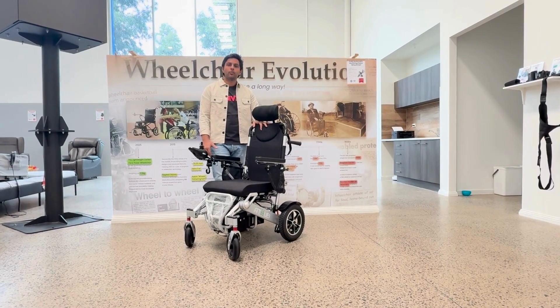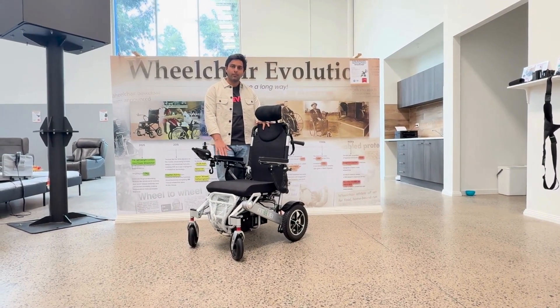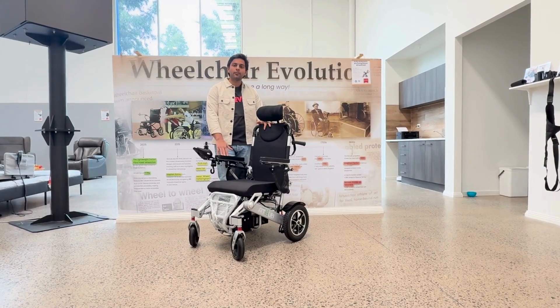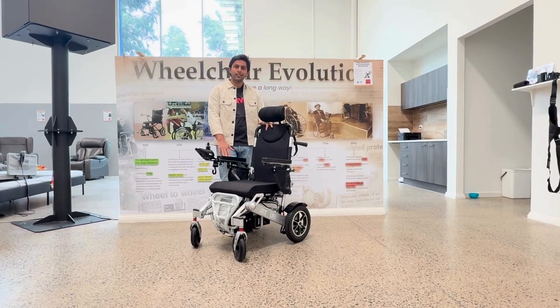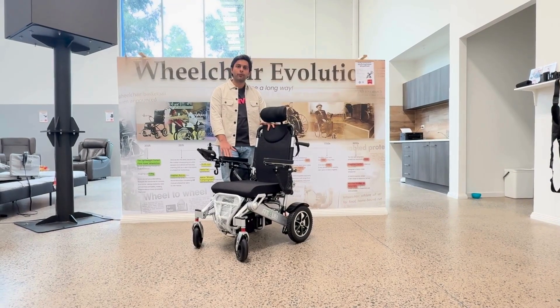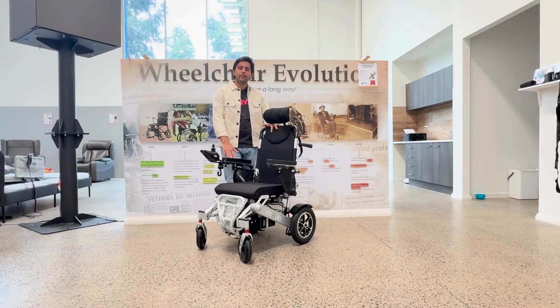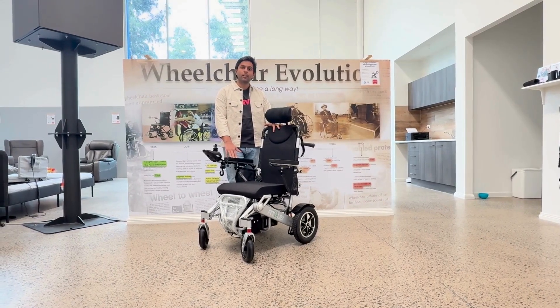Hi everyone, so today I will talk more about this fully automatic reclining wheelchair. This wheelchair is certified by TGA and the net weight is 28 kg and it can take up to 140 kg. The primary material of this wheelchair is aluminium and the motor capacity is 312 Wh.